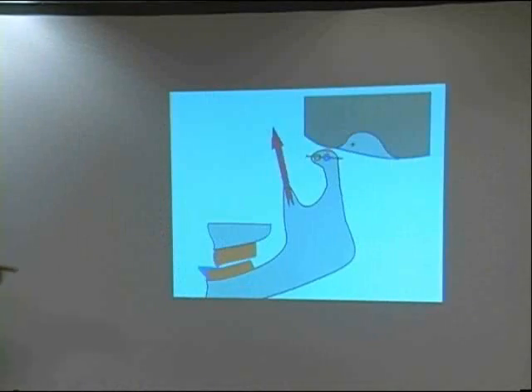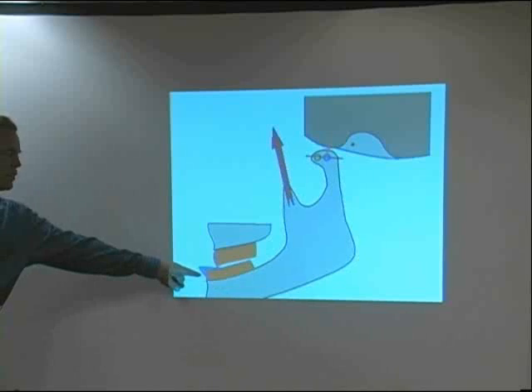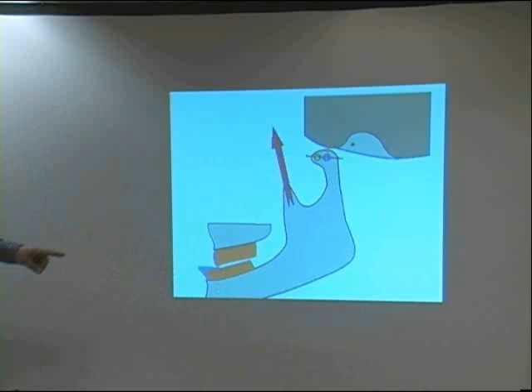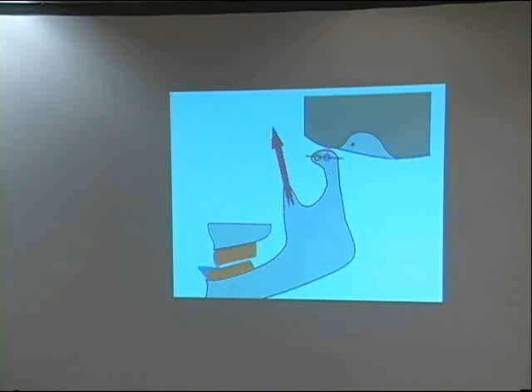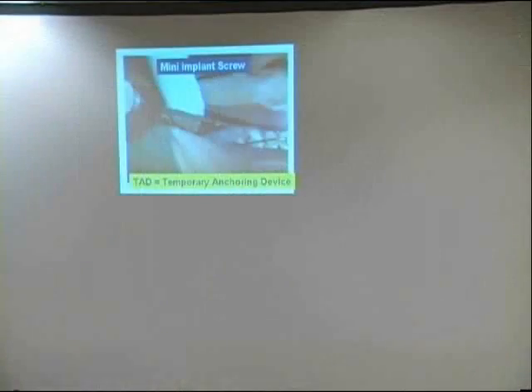Some people will protrude with their NTI device, and it's real easy to goof up and have the back end of this discluding element too tall. Because when you put it in, it's parallel with the mandibular plane, and when they protrude you get rotation and translation. The back end elevates as they protrude. We'll show later in the chairside sequences how you have to shave that thing down. We'll talk about anterior open bite a little bit more in detail.